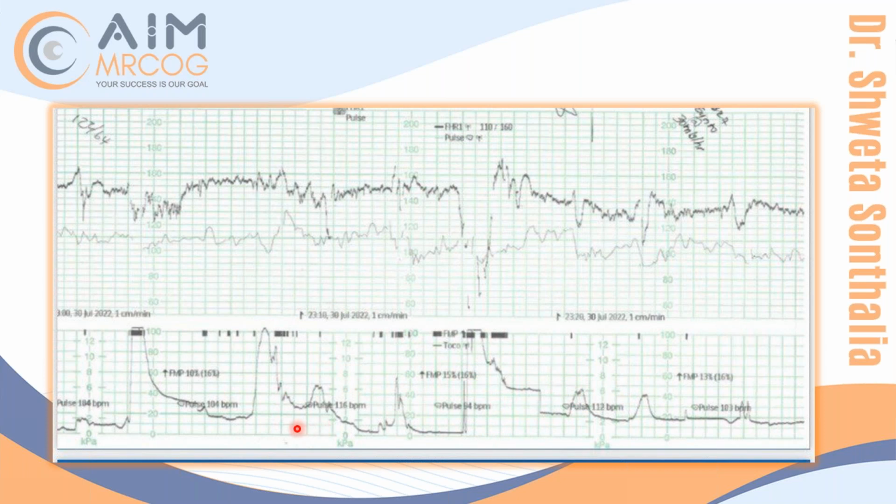Okay. And then the CTG is, I know this one is a difficult one. That's why I put this one. And this is from my hospital itself. That's why you can see the blood pressure is written and many things are written. The syntocinon started at 30 ml per hour, things like that. So if you see here, the baseline you told correctly.